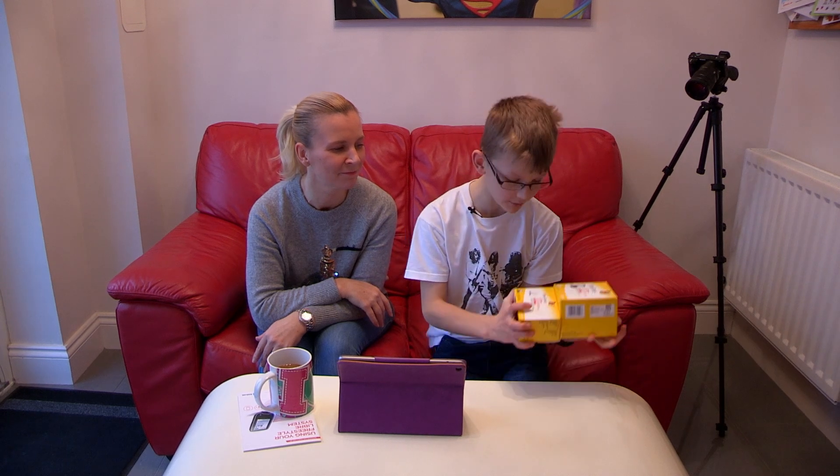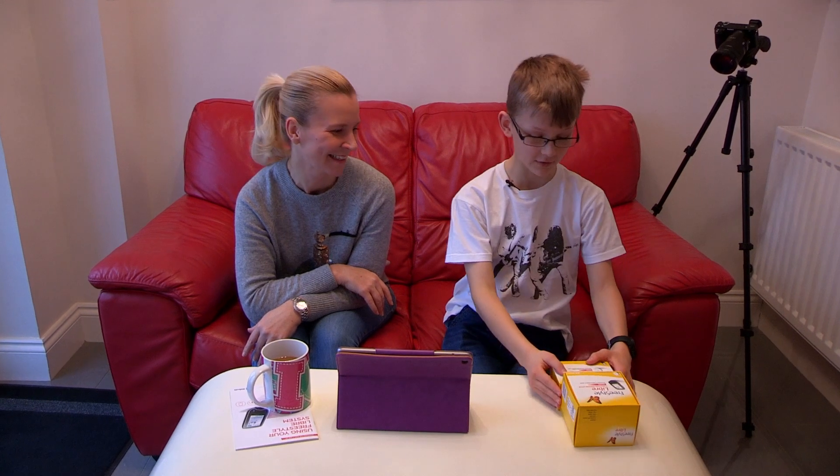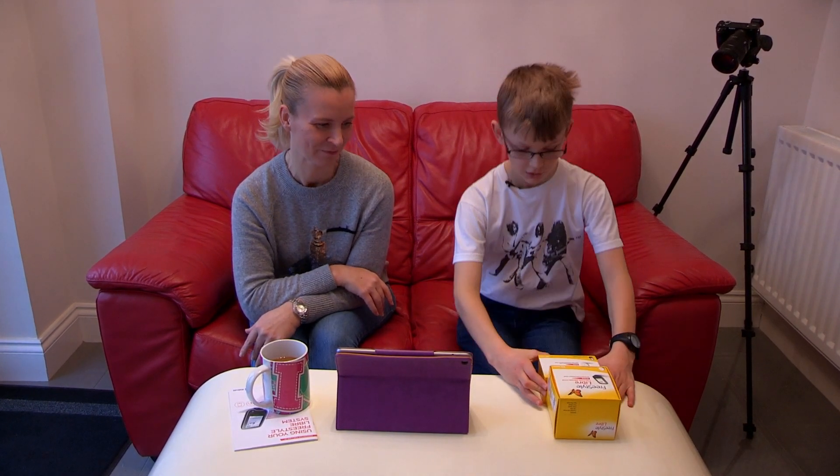Hello everyone, it's LLD here and welcome to another video. Today is another diabetic video and I'm doing something I've never done before — install and use my Freestyle Libre system. It's the first ever Libre for me, and MelGee here is going to help me fit it for the very first time.